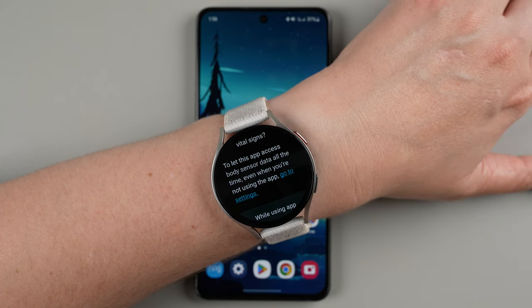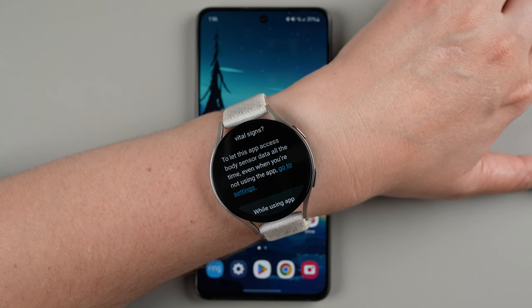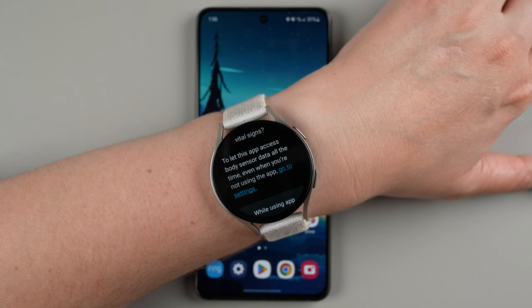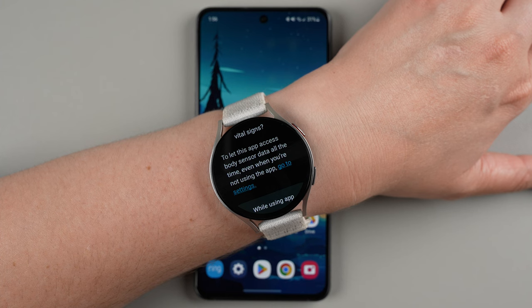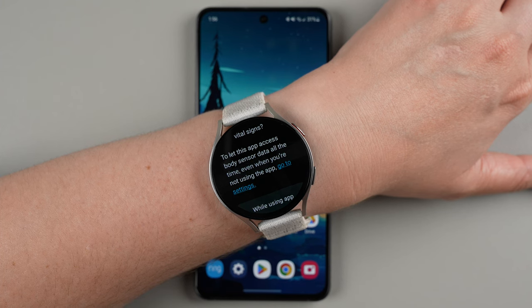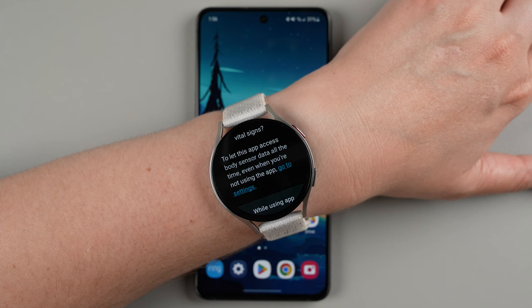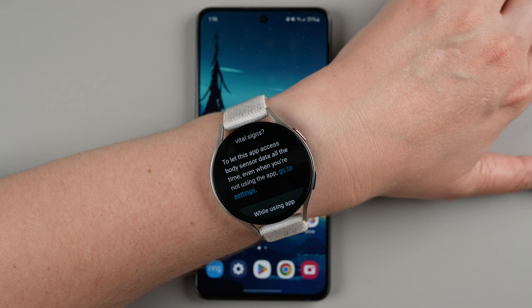If we scroll up a little, it says to let this app access body sensor data all the time, even when you're not using the app — go to settings. Now if you just want to take an on-demand ECG, you wouldn't need it to have access all the time. But there's also a feature called irregular heart rhythm notifications, which can measure your heart rhythm in the background continuously while you're wearing your watch, and it would then need to have access to data all the time.